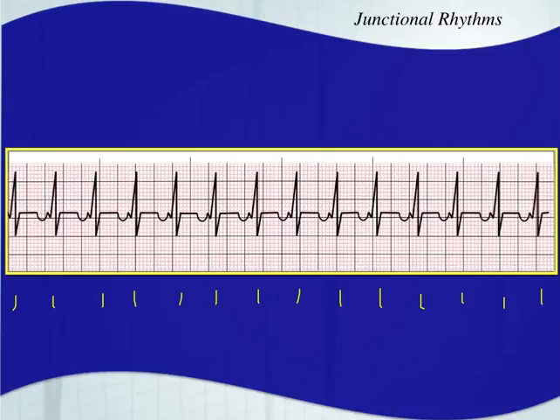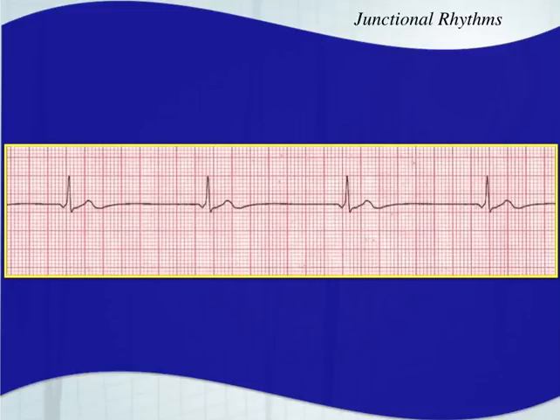Junctional tachycardia doesn't occur nearly as often as sinus tachycardia. In fact, it's very, very rare. You typically only see it as a reperfusion rhythm after cardiac catheterization for a myocardial infarction. Here's a real patient example with a junctional rhythm — the rate's about 40 beats per minute, only four complexes, inverted P waves with a nearly non-existent PR segment, narrow QRS complex, no extra P waves anywhere. This is a junctional escape rhythm.